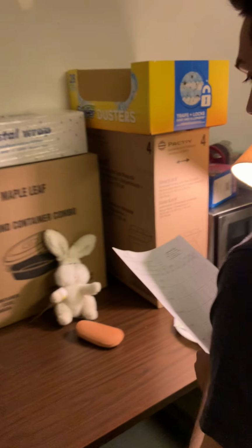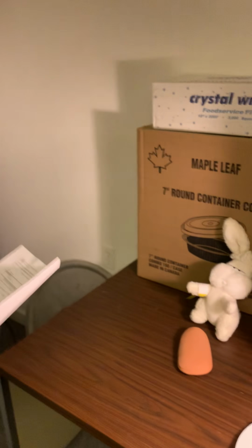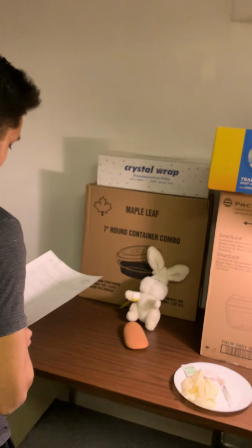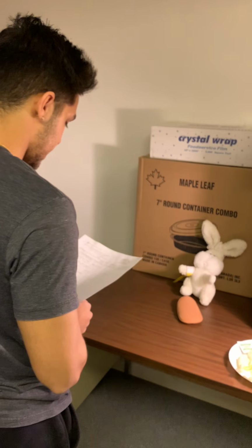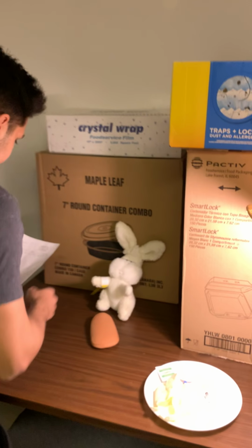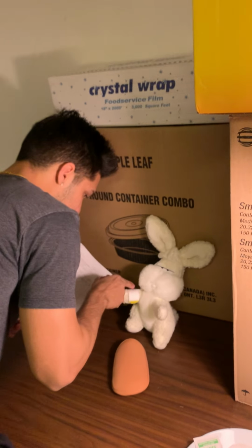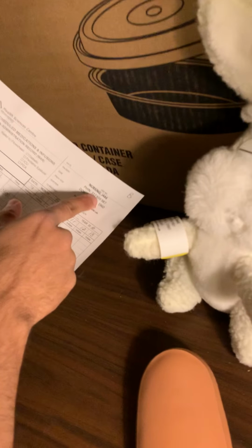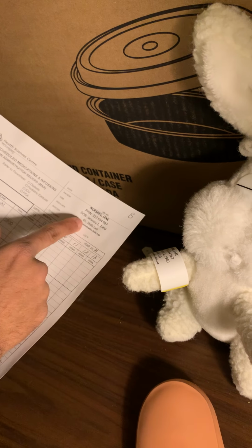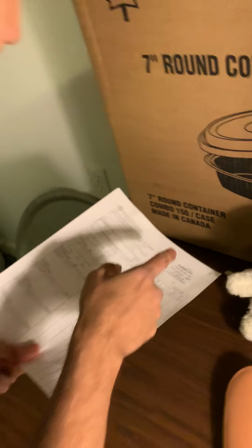Hi, Mr. My name is Mohit Kaushal. I'm a student nurse from the University of Manitoba. I'm going to be taking care of you today. Do you mind if I verify your ID with your armband? Perfect. Okay, nursing Jake. PIN 312-654-654-987-987. Date of birth January 1st. And over here it says no known allergies.